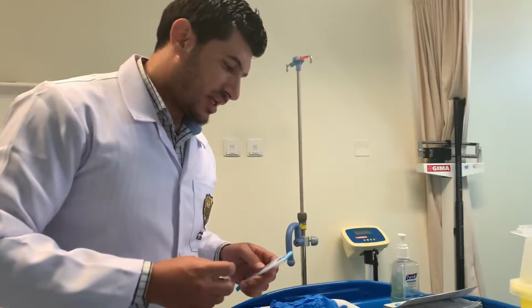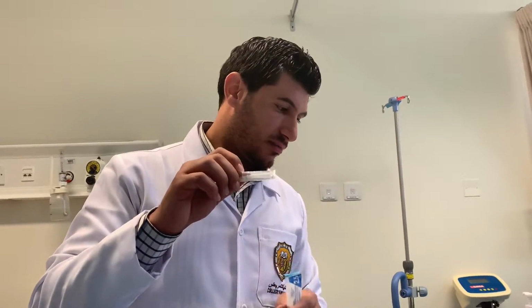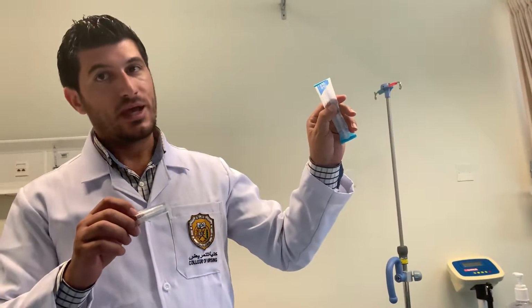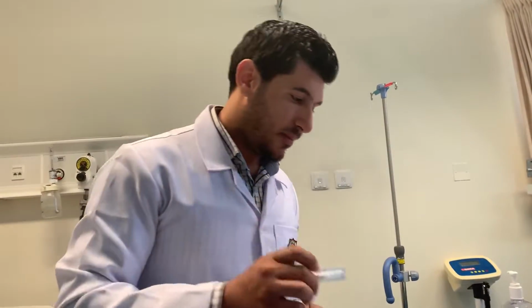Knowing that I'm giving a subcutaneous injection, I need a small length of needle, large gauge actually, which decreases the length because I'm targeting the subcutaneous tissues. If I choose a longer one, I'm hitting the muscle, so it will not serve its purpose.